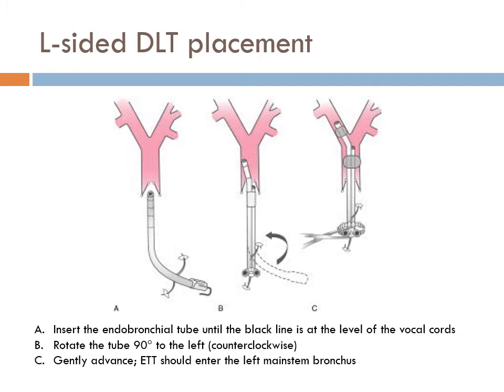So now you're on the left side. How far do you go with the tube? This is a question of, well, we don't want it to herniate, right? Typically, you'll see an image on here. You want to see just a little bit of the cuff up against the carina, and that's it. You don't want it so far that you don't see the cuff, or so that there's a lot of space between the carina and the cuff on the left side.